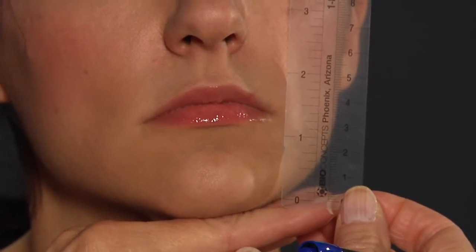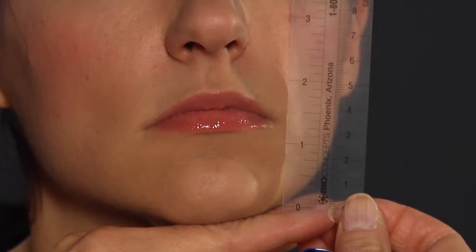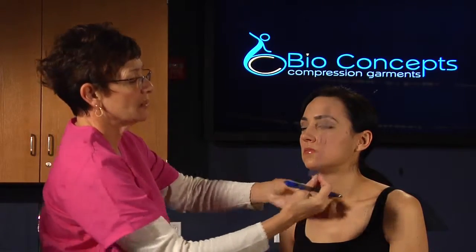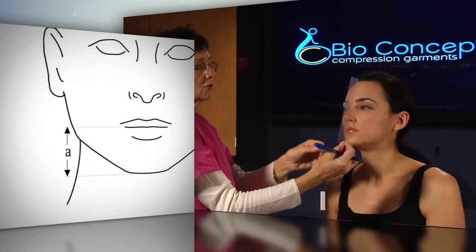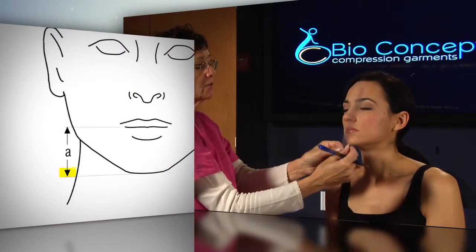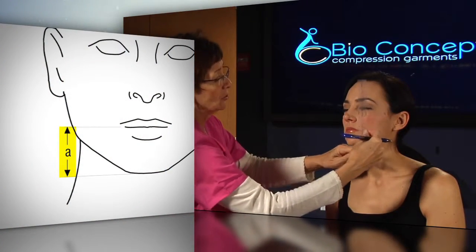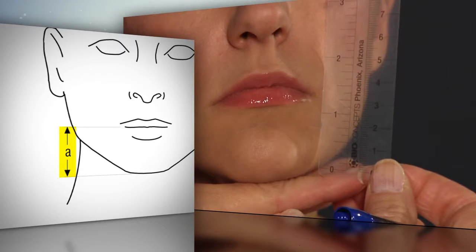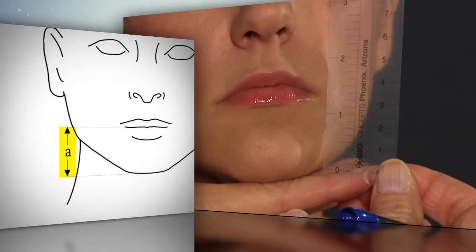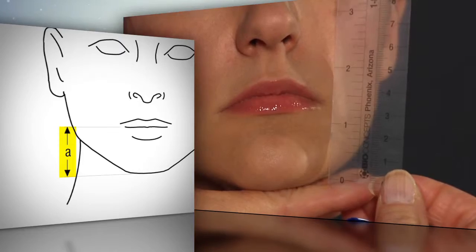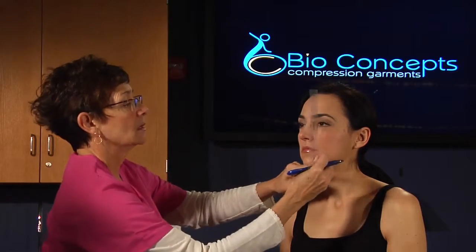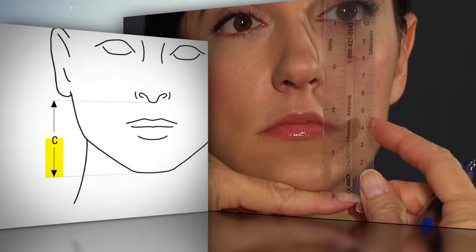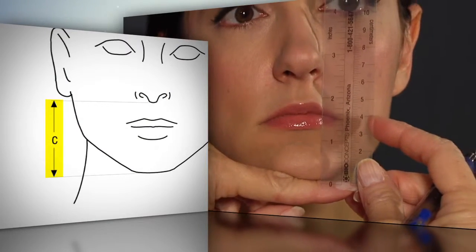Use the Bio Concepts clear ruler for distance measurements. The patient should be seated directly in front of the measurer. Measurement little a is from the base of the chin to the center of the mouth — put something under the chin to see the base of the ruler, and make sure you measure from the zero mark, not from the bottom of the ruler. There is no little b measurement. Little c is from the base of the chin to the base of the nose.